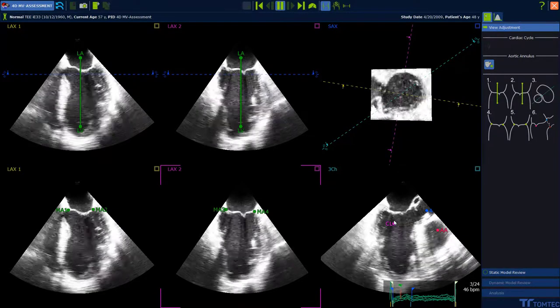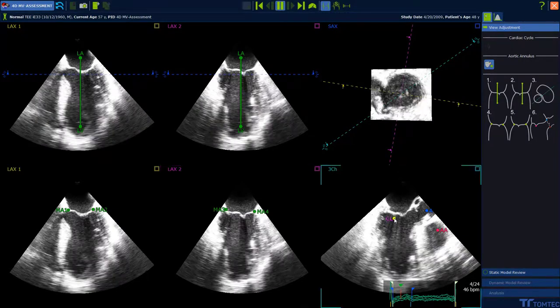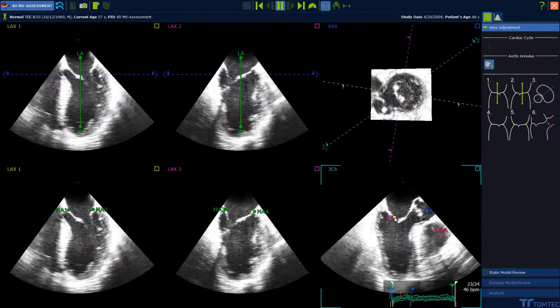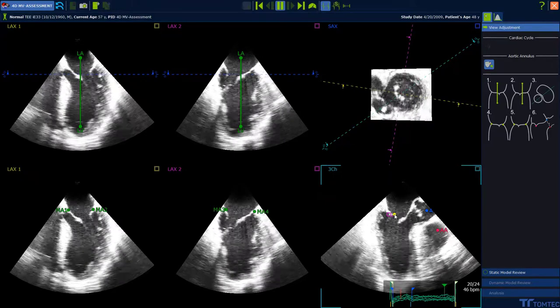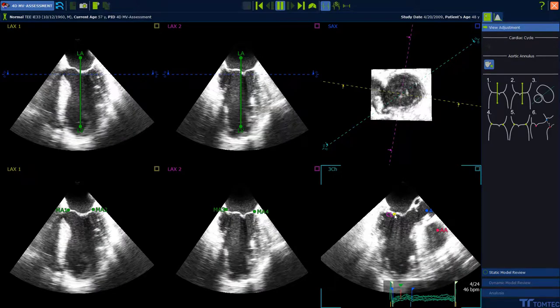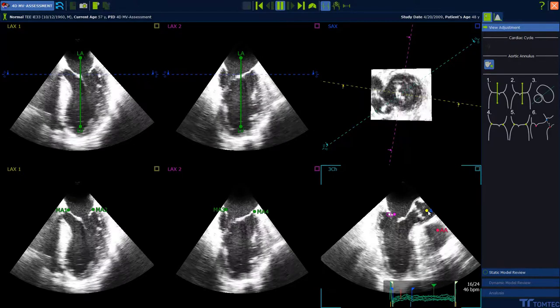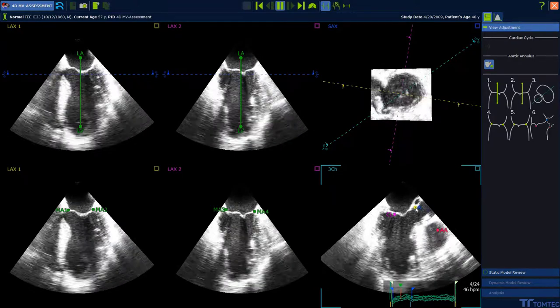The coaptation point has to be positioned at the leaflet tip. And bring both aortic annulus points into the correct position.